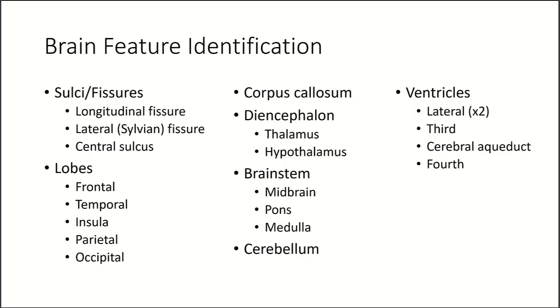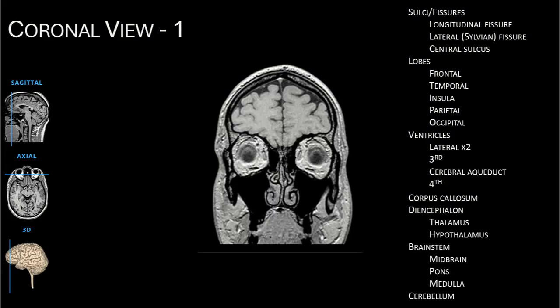These are the brain features to look for as we scroll through different views. Starting with the coronal view, we will look for the features listed on the right. Not every feature can be seen at any given position. This is our first coronal view; we will sequence posteriorly for a total of six views. At this very anterior position, we can find the frontal lobe and the division between the cerebral hemispheres called the longitudinal fissure.